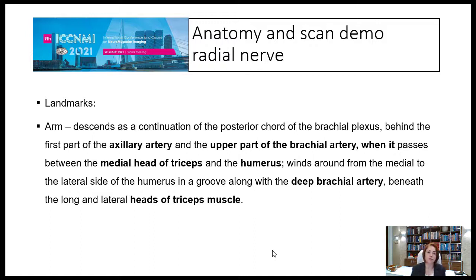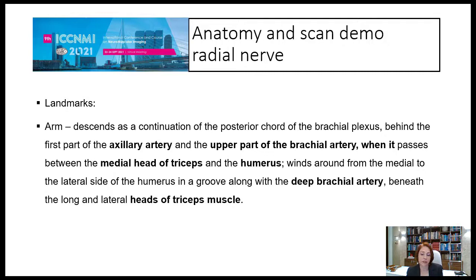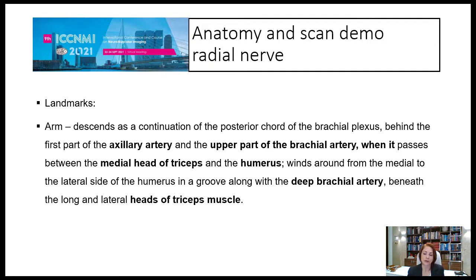The radial nerve is the largest branch of the brachial plexus. Landmarks are important to guide you to recognize where you can find the nerve. In the arm, the nerve descends as a continuation of the posterior cord of the brachial plexus, behind the axillary and brachial arteries, passing between the medial head of the triceps and the humerus, winding around from medial to lateral side in a groove along with the deep brachial artery, beneath the long and lateral heads of the triceps muscle.